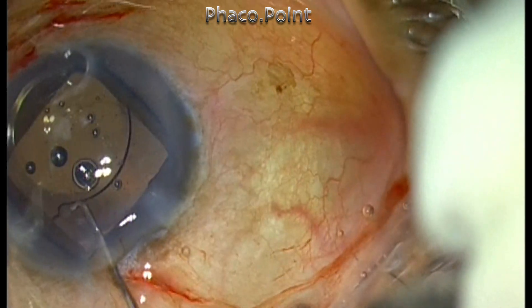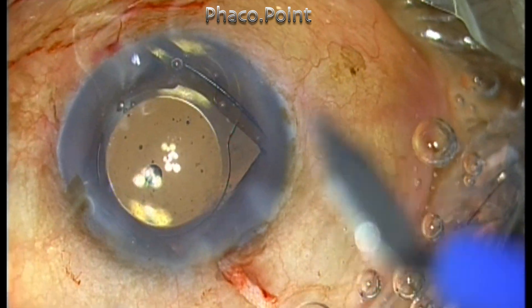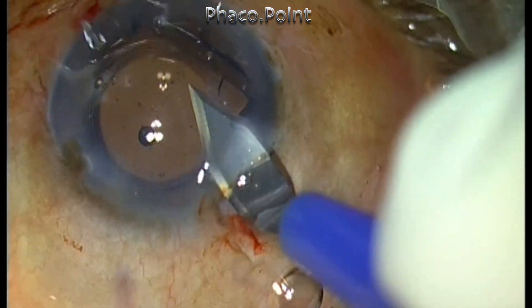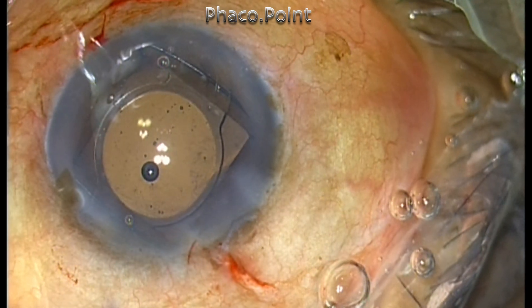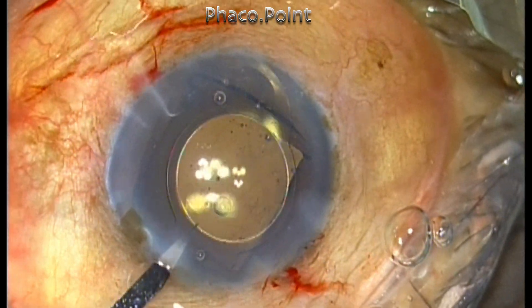You have to orient the IOL so that the haptics are facing at right angles to the incision. The incision also needs to be slightly enlarged from 2.8 to almost 4 millimeters, which makes it more comfortable to remove the lens. The side port is also slightly enlarged to allow the intraocular forceps to enter.